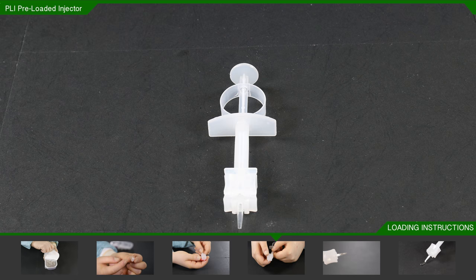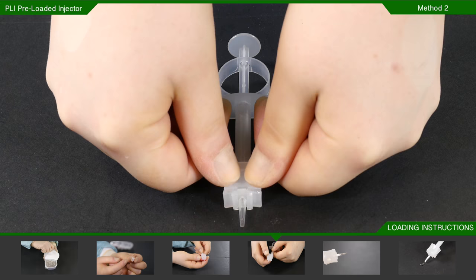Place the PLI with the loading tab facing upwards on the sterile table and using both thumbs, press the tab firmly.